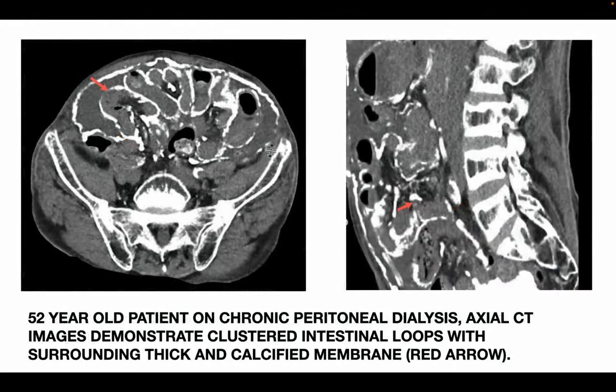This is another case of a 52-year-old patient on chronic peritoneal dialysis. Axial CT images demonstrate clustered intestinal loops with a surrounding thick and calcified membrane, as depicted by the red arrow.